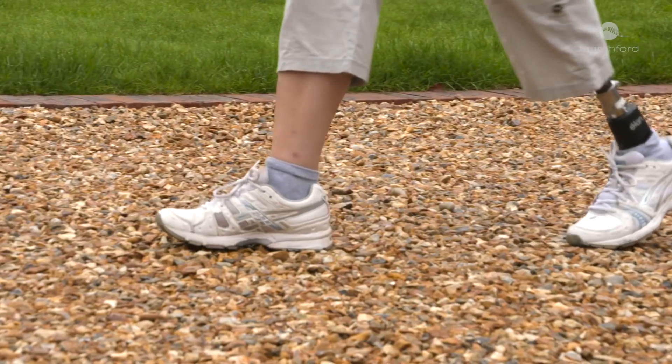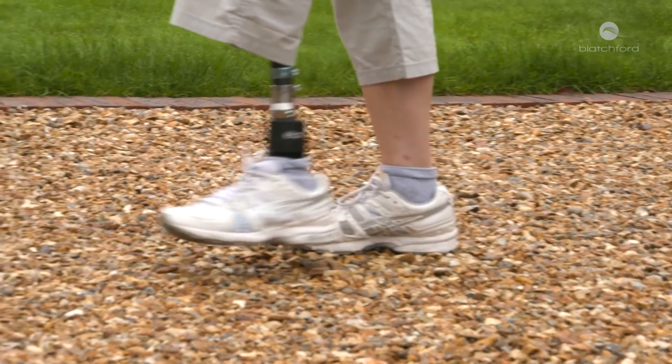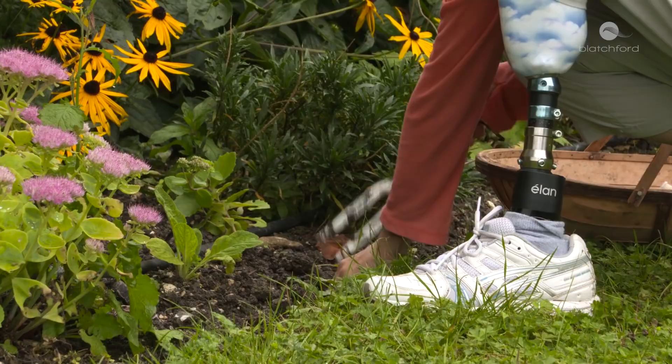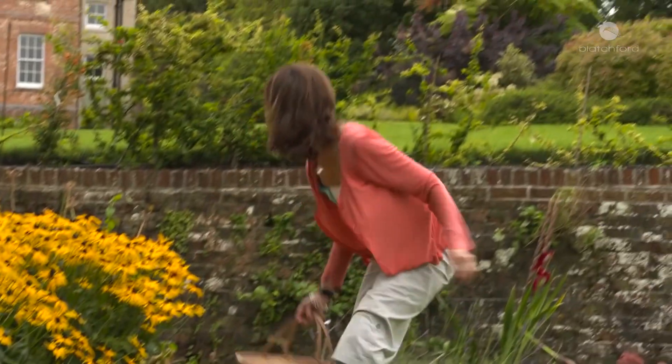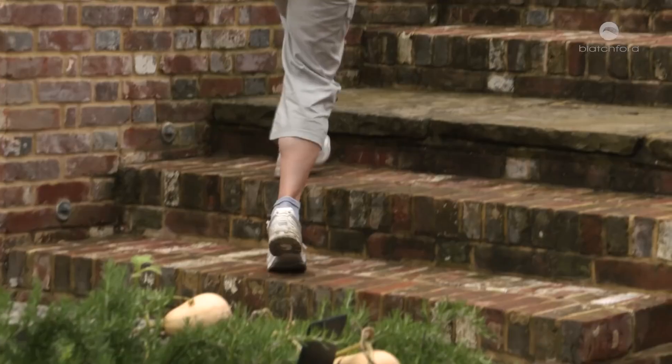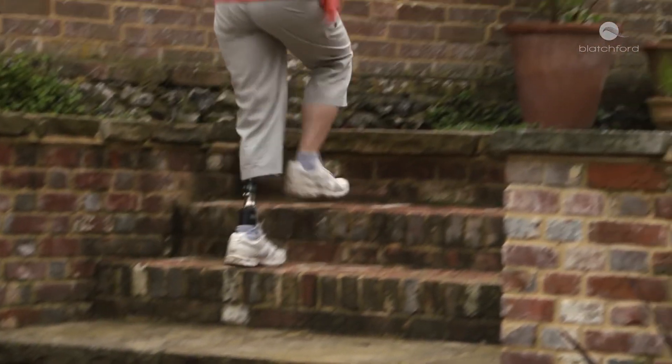When I tried the Elan for the first time it was really a revelation, because I'm used to rigid ankles and suddenly there was this fluid ankle. I could move my knee and the ankle would respond to my knee moving. I would then walk and it was a much softer, more natural feeling.